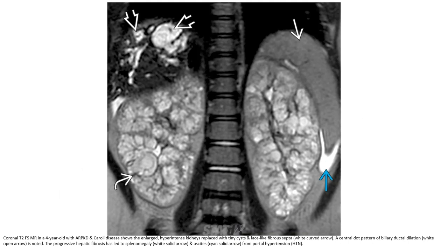A T2 FS MRI of a 4-year-old with autosomal recessive polycystic kidney disease and Caroli disease shows large hyperintense kidneys replaced with cysts, and a large liver with fibrous septa. The central dot pattern of biliary duct dilatation is noted. Progressive hepatic fibrosis has led to splenomegaly and ascites from portal hypertension.